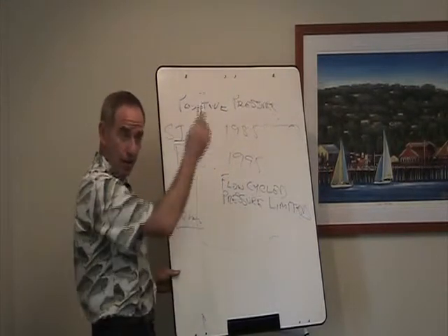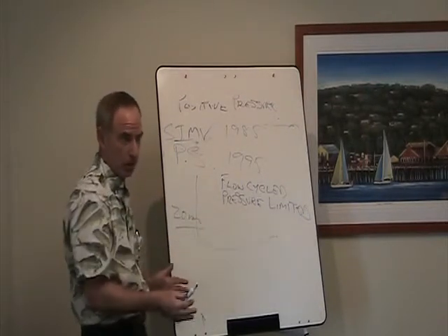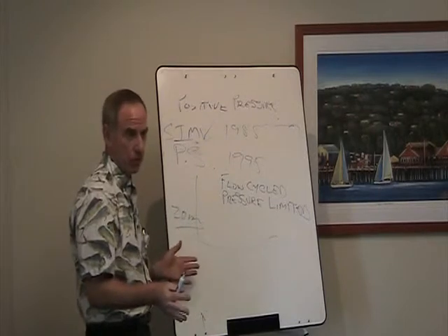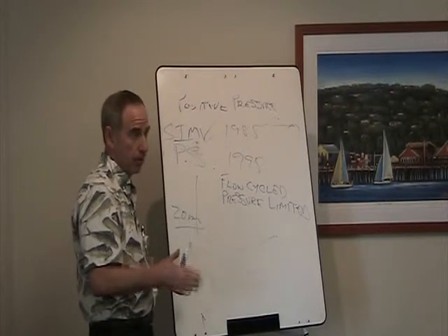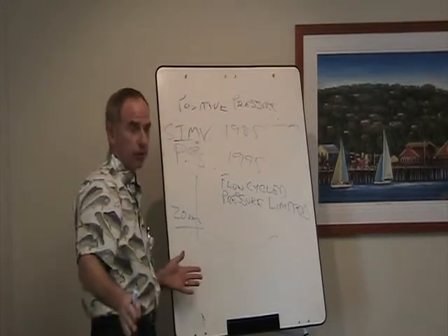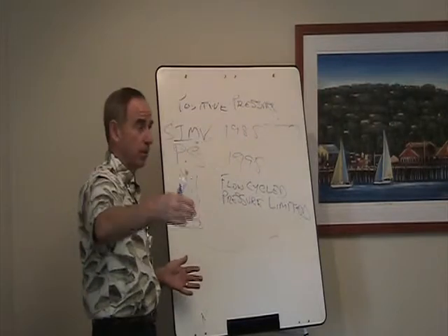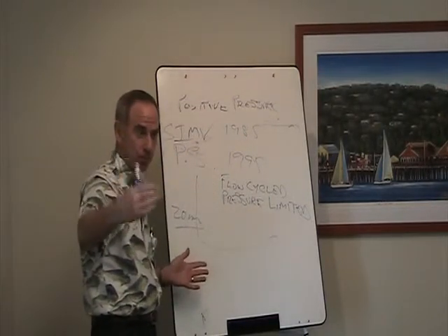Okay, very similar to that old kind of pressure, the first one we talked about, the Bird ventilators. But there are some significant differences. On that type of ventilation, you would dial in a pressure, and the ventilator would trigger up to that pressure, and then it would drop off, and that would be the end of it. It would release. And that has to release, or else you can't breathe out, right?